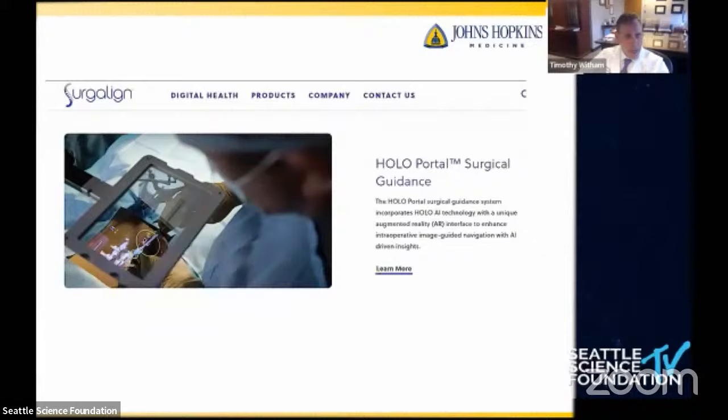And the augmented or composite images are overlaid onto the surgeon's view of the operative field through that translucent screen that you can see there.